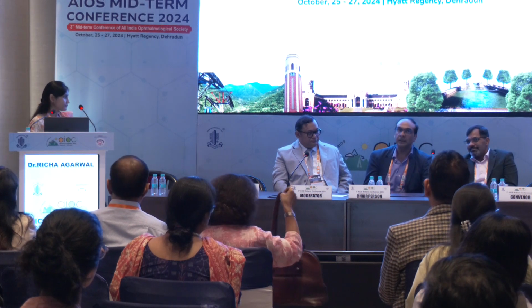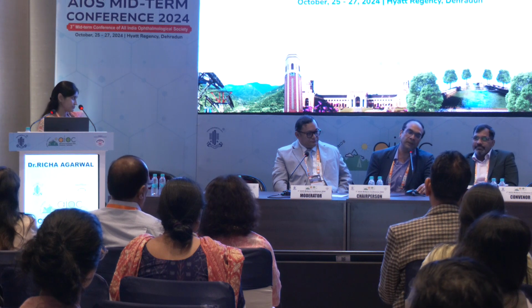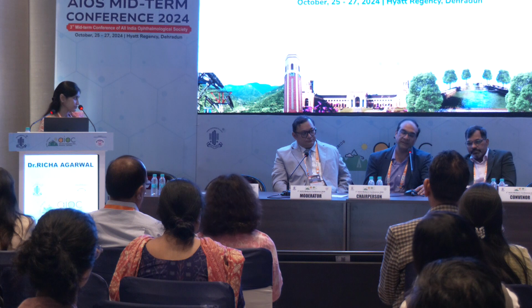And the other important thing is the biometry. If you are not doing a good biometry, whichever formula you use won't help. So applanation biometry is out of the question. If you are doing an immersion scan, do it well, because everybody might not have an optical biometer. So it's imperative to do a very good immersion scan.